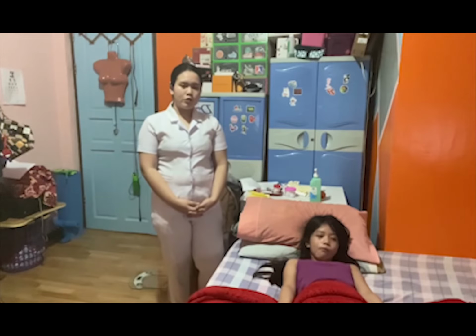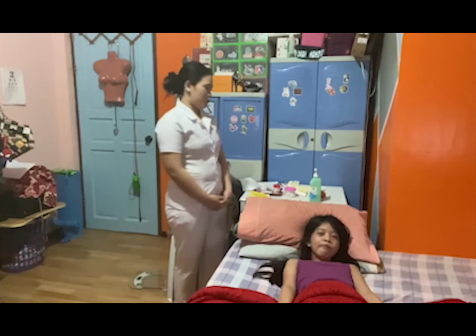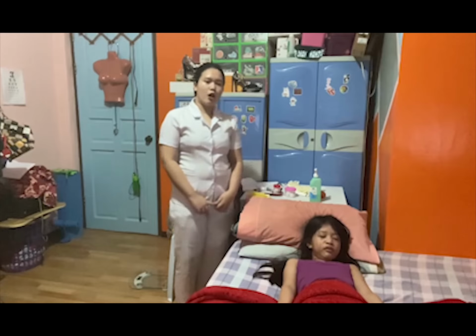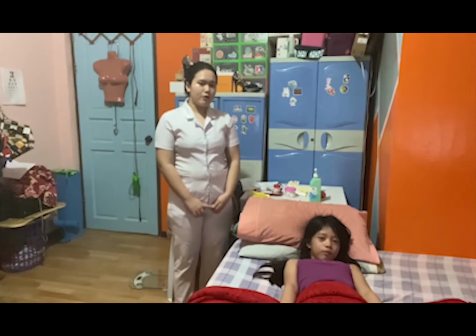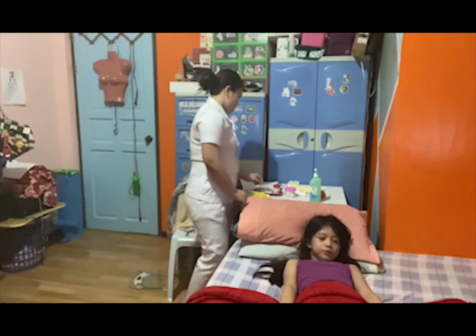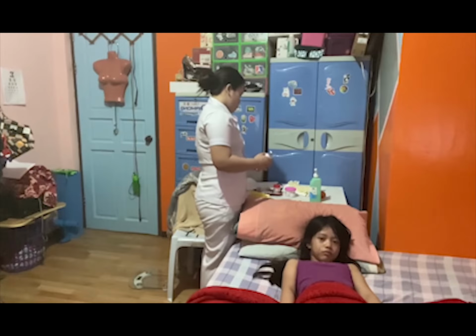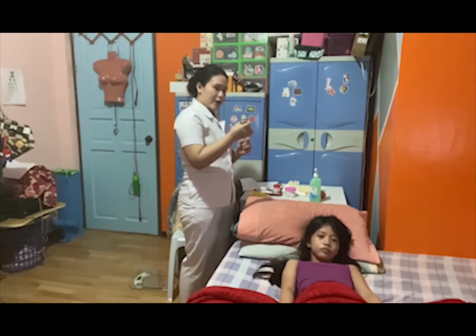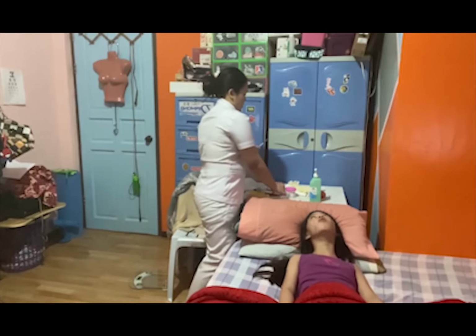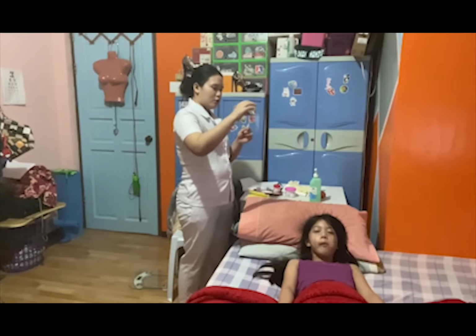Now I'm going to use the tuberculin syringe for the intradermal injection. And choose the medication of the patient and the ml. Okay. So remove the cap. Then shake the bottle.